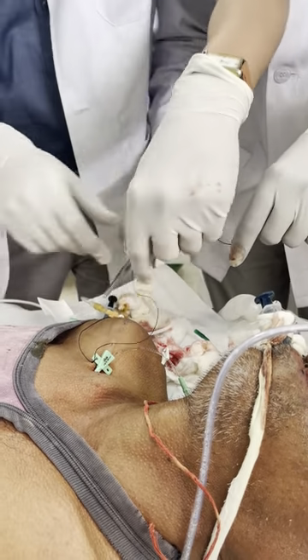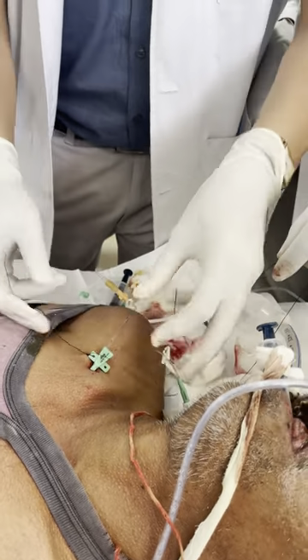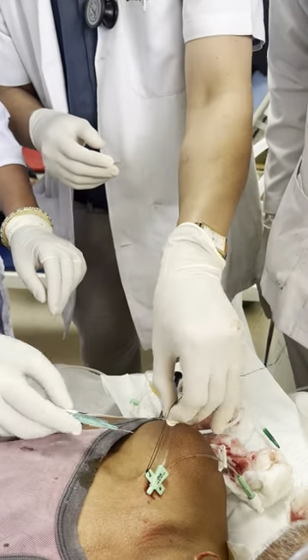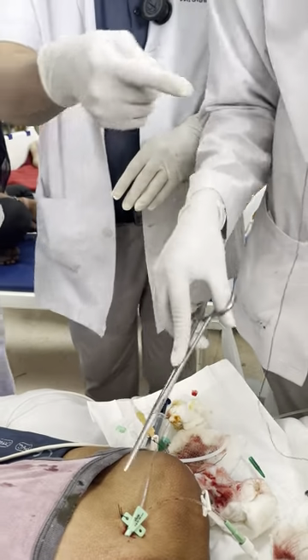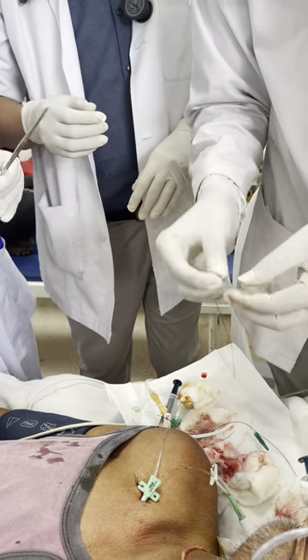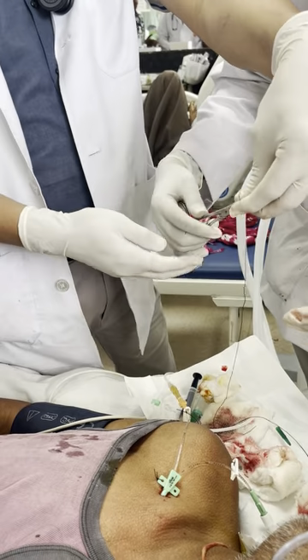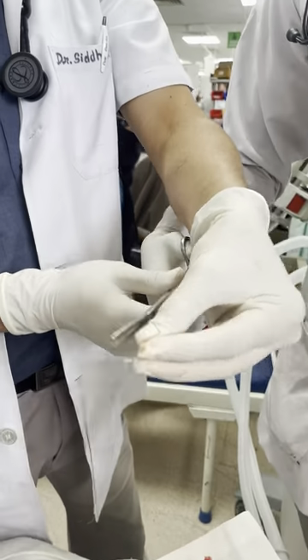Okay. And if you want to do it by hand, you can also do this. Same job which you were doing by this. Surgeon's knot. If you want to do this faster, you can do like this. Surgeon's knot. Yeah, it is surgeon's knot. Ab you do it on the left. Another. This is a thoda lamba. Bas theek hai. Lagao ek knot. You can do it by hand or this, whatever you consider appropriate. Are you left-handed or right-handed? Right-handed. So since you are right-handed, keep this leg. Open this. So the right-handed maneuvering, this is the real.